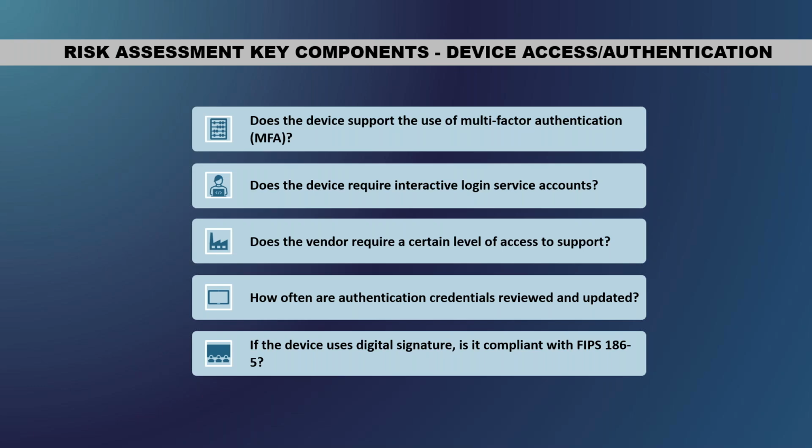Most people, hopefully, yeah. I mean, normally medical systems, not all of them can have MFA, and that's something to keep in mind. But if it is, what you have to understand is that if you're watching and maintaining your passwords, you have to have a password policy. You need to make sure that they're being updated regularly. If they cannot, you need to work with the vendor to say, what's the process for us so that we can make sure it's at least updated annually or every 90 days or whatever.